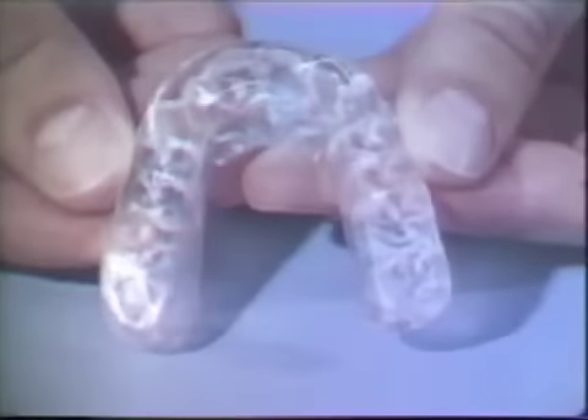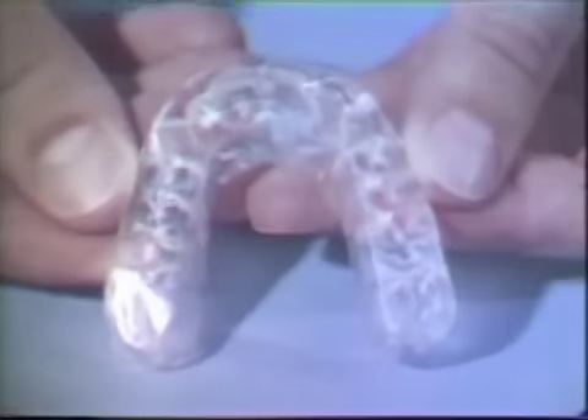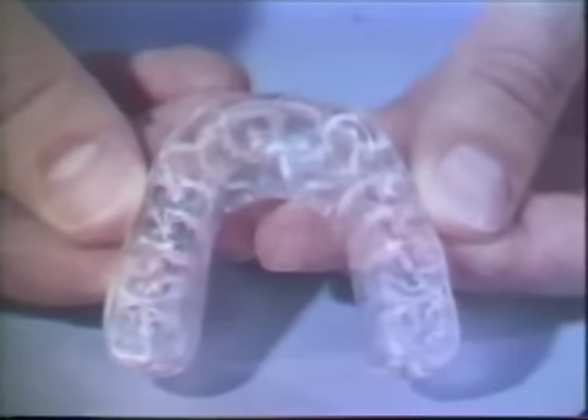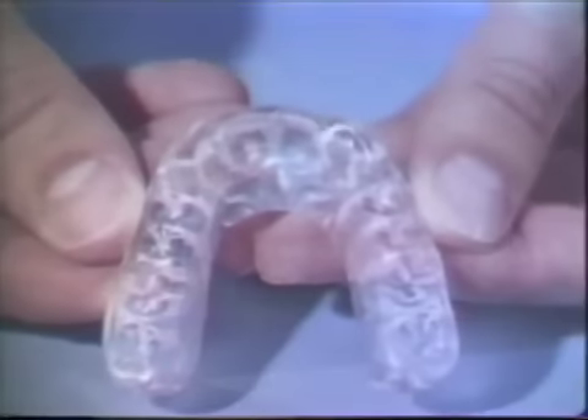The bite plane has been polished to a high gloss and is ready to be delivered. The polishing should be done carefully so no occlusal contacts are lost. As the bite plane is delivered, it is given the final test. The patient is asked if it feels smooth and comfortable. It should feel even both in centric relation and in the various eccentric excursions.